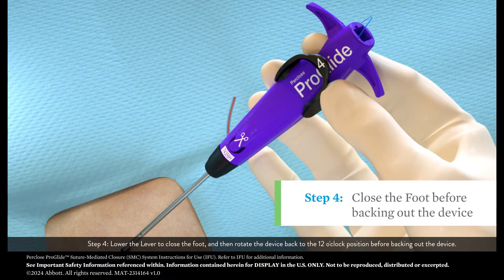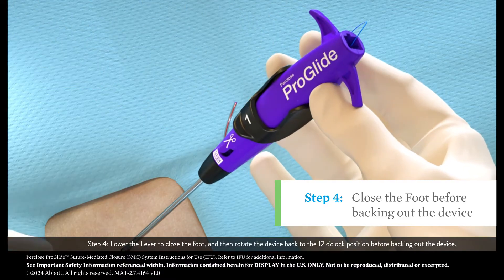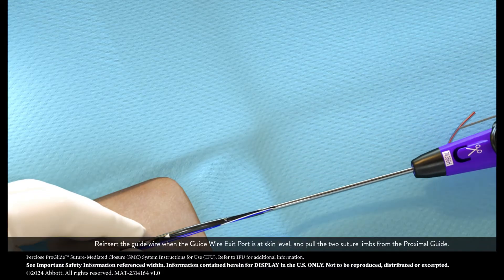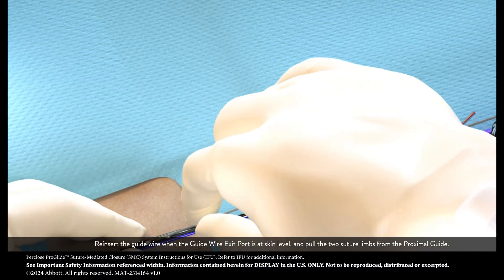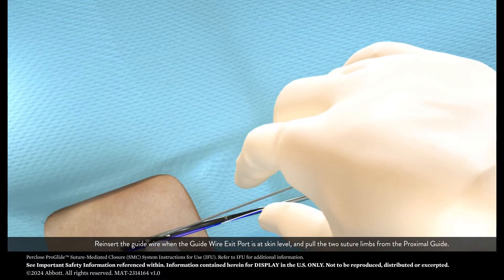Step 4: Lower the lever to close the foot, and then rotate the device back to the 12 o'clock position before backing out the device. Reinsert the guide wire when the guide wire exit port is at skin level and pull the two suture limbs from the proximal guide.